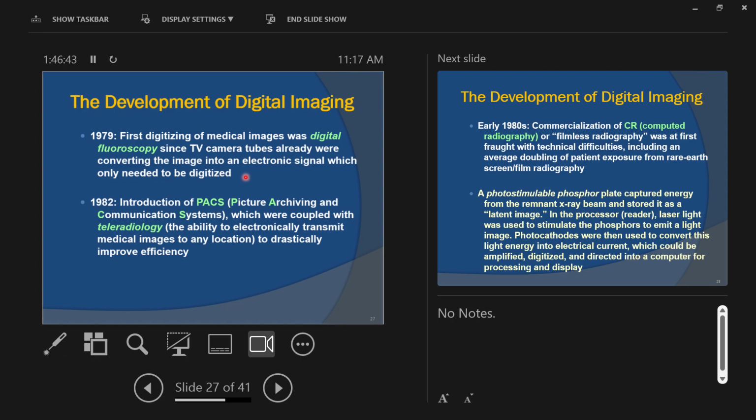If you guys remember the old TVs, the old big, deep TVs, right? By the way, they were cathode ray TVs. That big thing inside the TV was a cathode ray tube. That's why we called them the tube sometimes. You've heard them called the tube before, right? That's why they're called the tube, because inside of those old TVs was literally a cathode ray tube, and they produced what we call an analog image signal. I won't go into a bunch right now about what analog and digital really mean. We'll do that in the digital module, but analog and digital are different. Those old TVs that we first used produced an analog image signal.